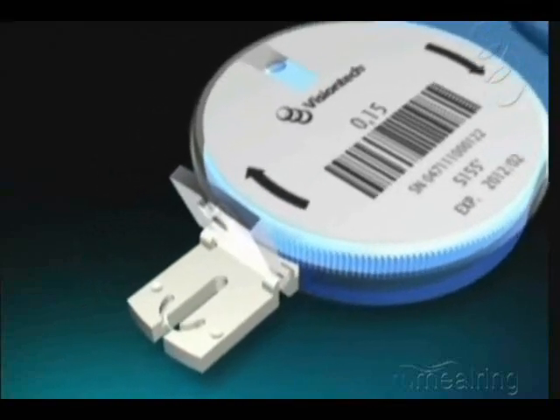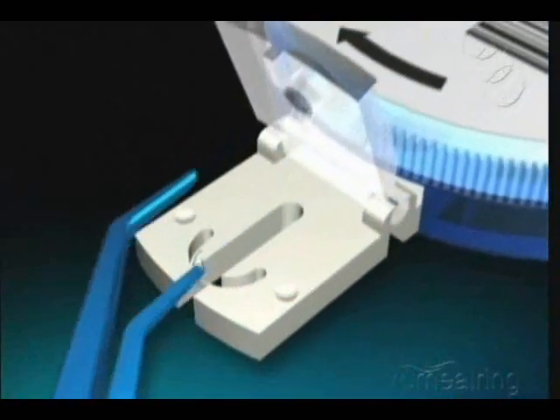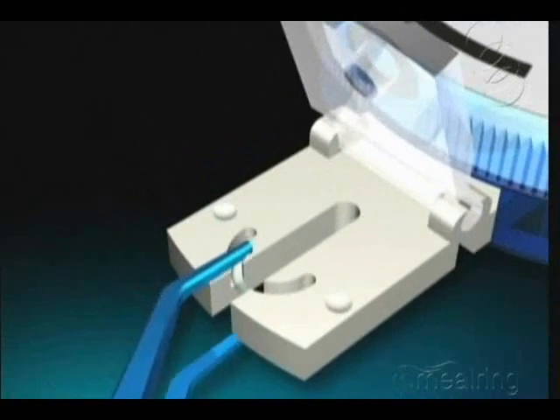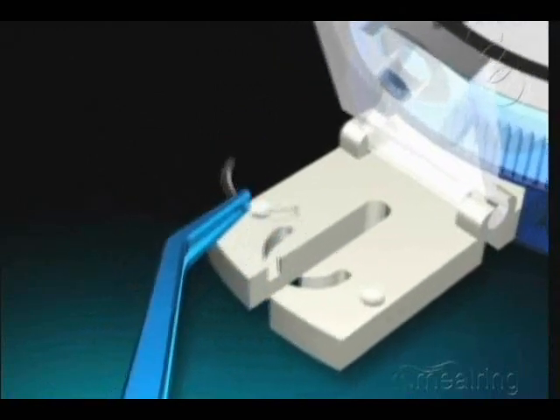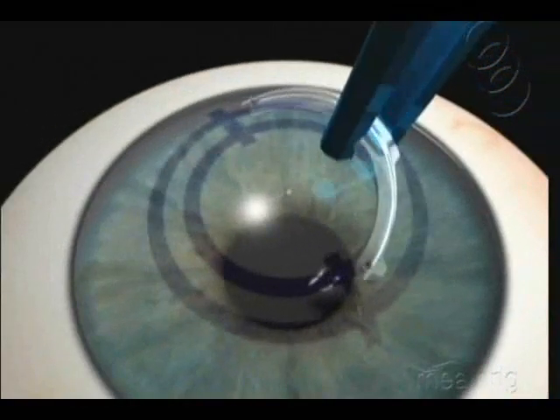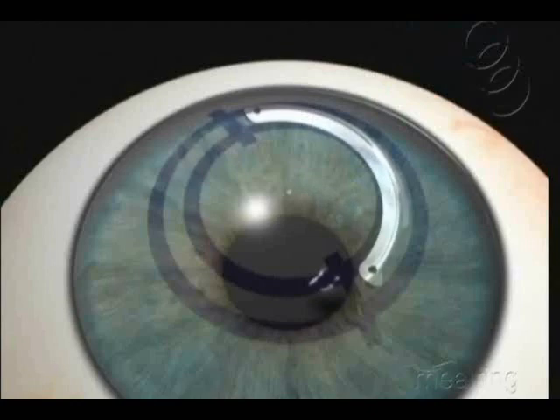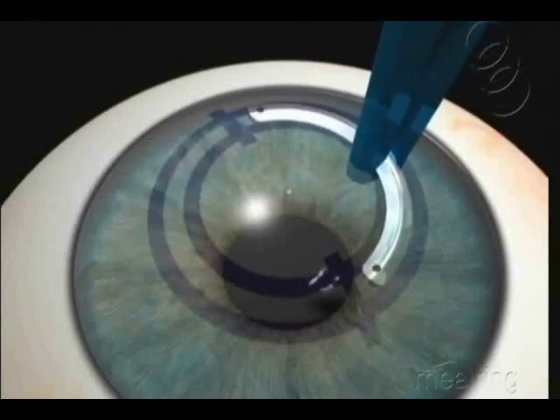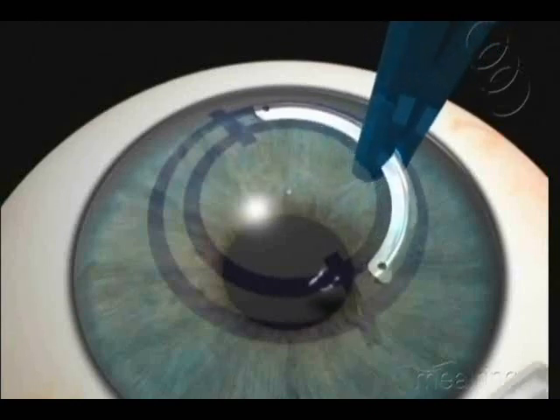Remove the corneal ring from its case using a modified McPherson forceps. Leave the ring on the cornea, observing that its steepest side is put upward. Hold the segment with the modified McPherson forceps at its middle portion.